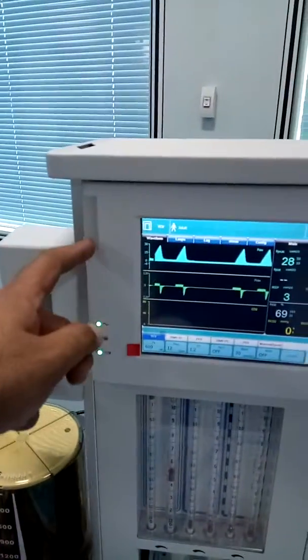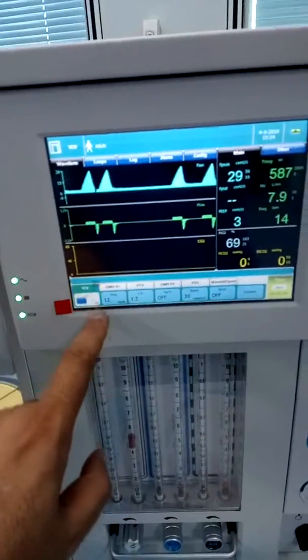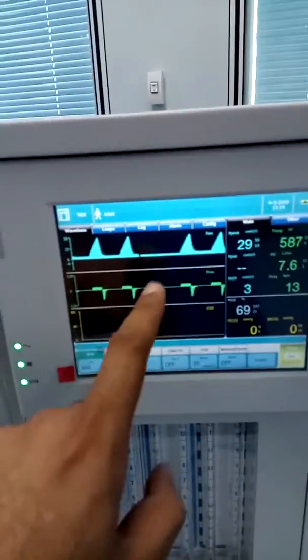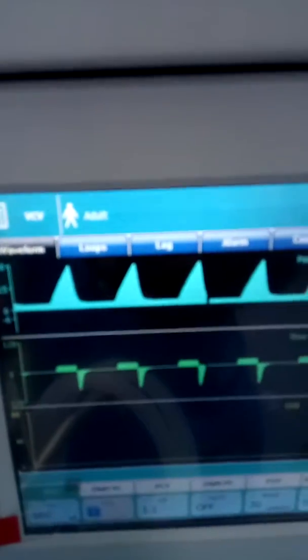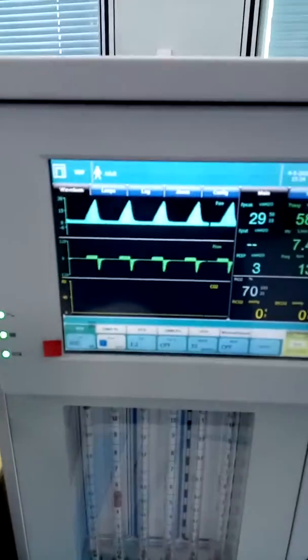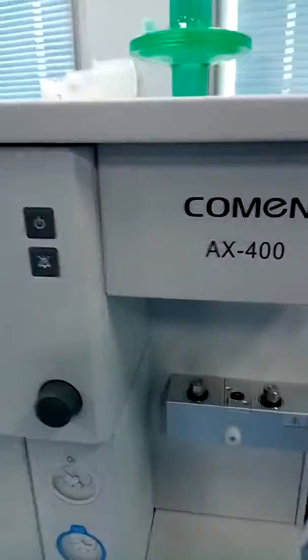This is the alarm. This is the touch-screen ventilator — a full screen where you can simultaneously see three waveforms. This is working in volume control mode right now, and an adult patient is selected. Let me go to the back side of the machine.